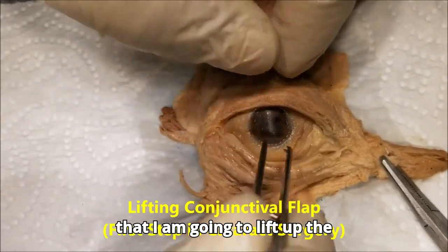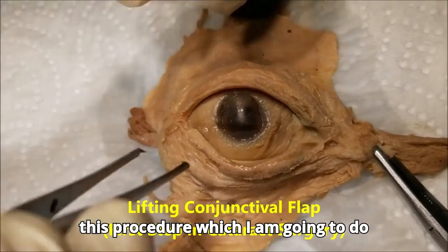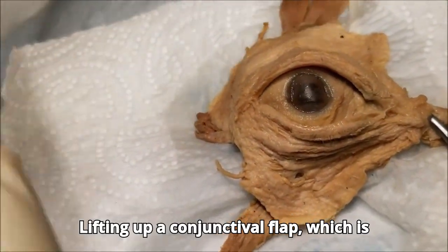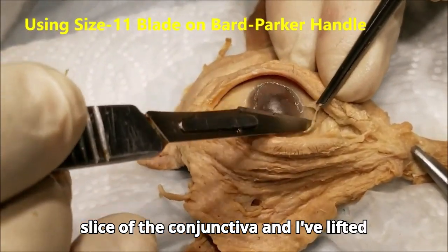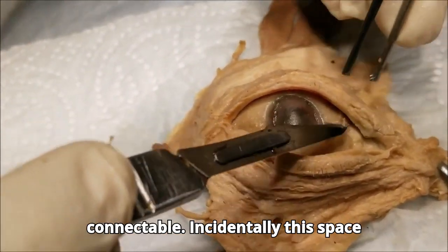So having mentioned that, I'm going to lift up the conjunctiva and slice it open. Incidentally, this procedure which I'm going to do right now, this is the very first step, lifting up a conjunctival flap, which is done in cataract surgery. So let's go ahead. I've made a slice of the conjunctiva, and I've lifted up a flap of conjunctiva. What you see in front of you is the flap of conjunctiva.